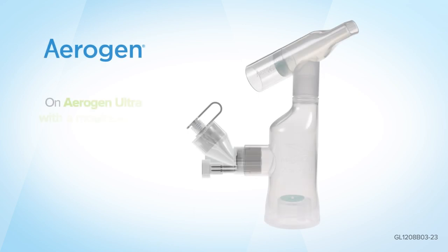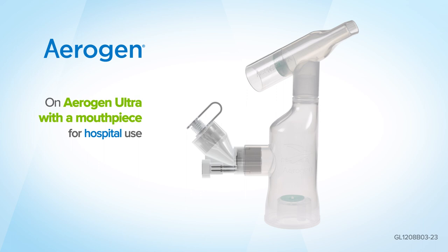This is an example setup of the Aerogen Ultra with a mouthpiece for hospital use. Please consult individual manufacturer's instructions for use, as setups may vary.